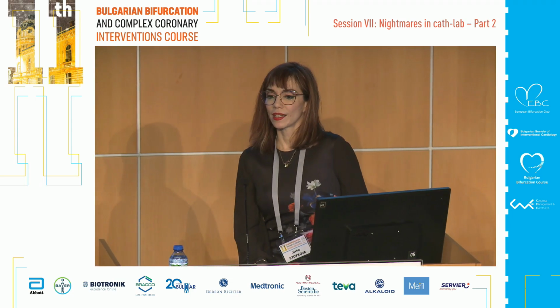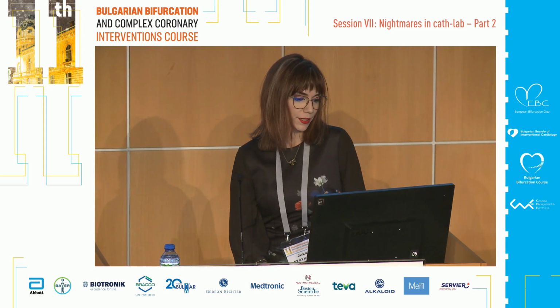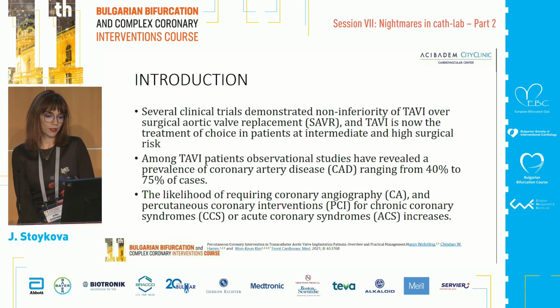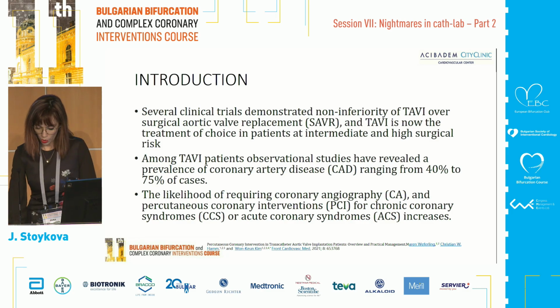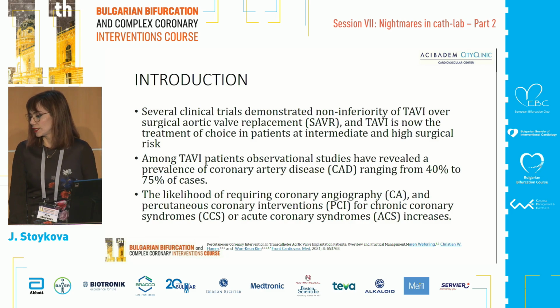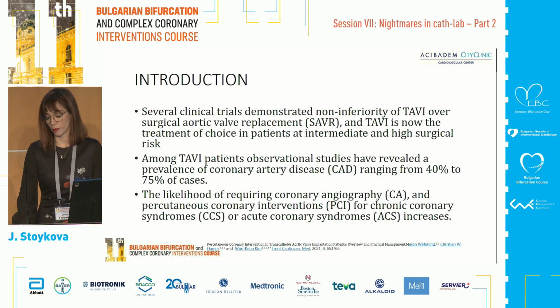Hello. Thank you for the opportunity to present one of our nightmares in the cath lab. It's about a TAVI patient. A few words about the TAVI procedure, which is emerging more and more in clinical practice, especially after data that TAVI is okay in intermediate risk and high risk patients.